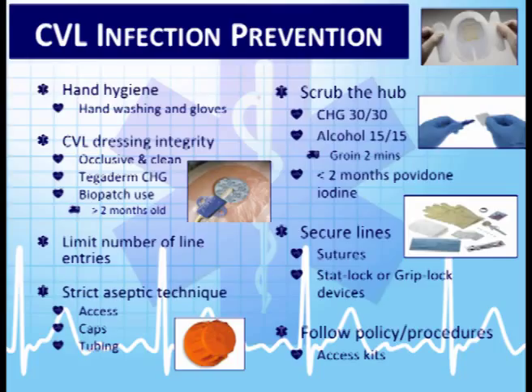And for accessing the central lines, the ambulances should have the sterile gloves, and we'll practice that a little bit later. The central venous line dressing integrity, what does the dressing look like? Okay? If we're taking them from home, they may not have anybody there to do their central line dressing. However, if you're doing a critical care transport and that dressing is not occlusive and doesn't look right, they really need to change it at the facility before you transport that patient.